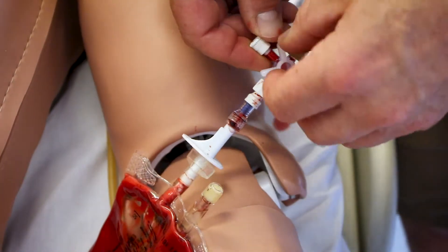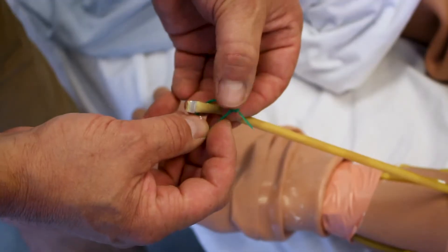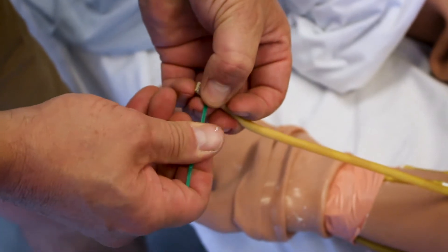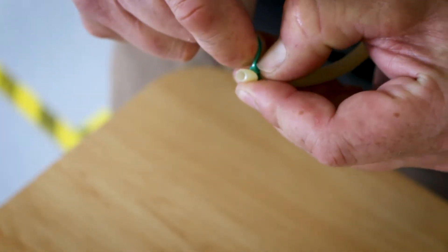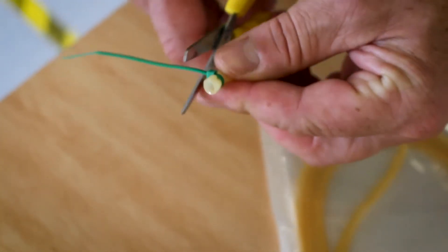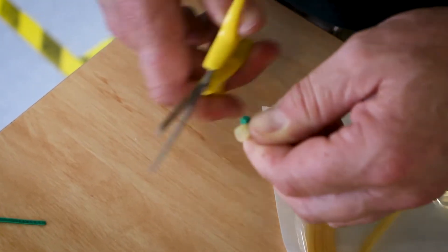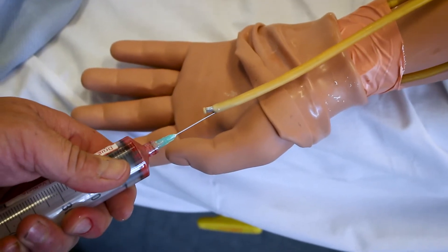We've used a 100ml bag of saline with an IV bag spike, and just put a three-way tap in between to make it easier to fill or empty the bag. Next, seal the end of the tube — we've used a blood bag clip, but you can also use a miniature cable tie.